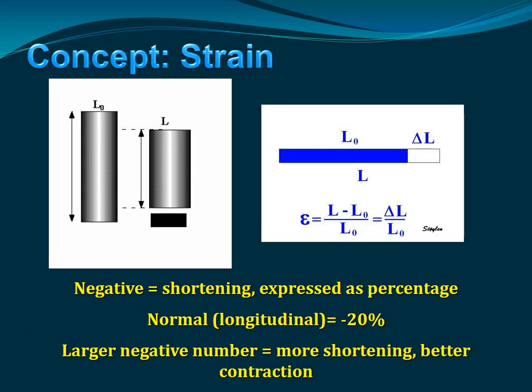The next thing, which has been around commercially since 2005, is what we call myocardial mechanics imaging, and the concept is strain. Strain comes from physics. It measures deformation in one axis. We can do that, of course, in many axes. But what we have is an unstressed length of a material, and then we either lengthen it or shorten it and measure the change by percentage.